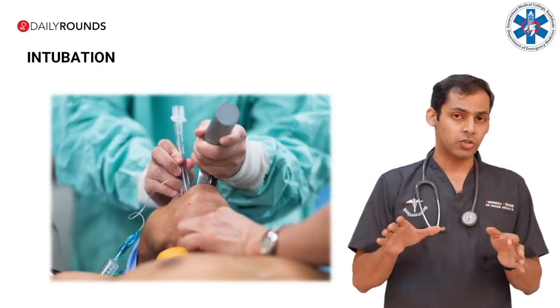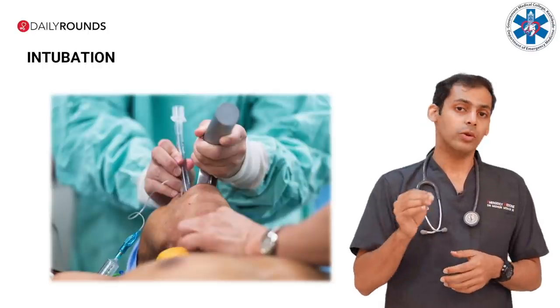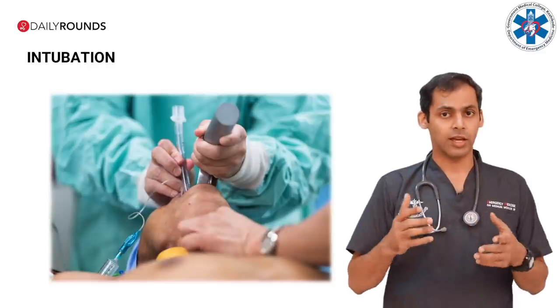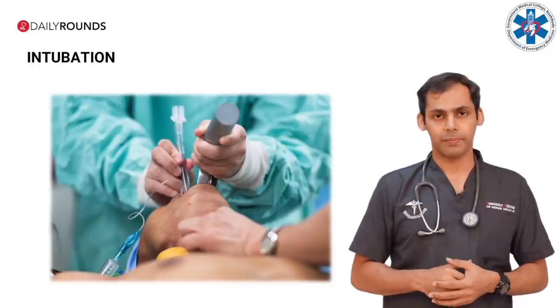Now, what if the patient is too sick? His sensorium is poor, he is not making adequate breathing effort, he is not maintaining his airway, and there is pooling of secretions in his mouth. Then you need to protect his airway as well by intubating him. Although the act of intubation is associated with the greatest risk of aerosol generation, once you intubate the patient using adequate precautions and inflate that cuff, it is associated with less aerosol dispersion compared to NIVs.